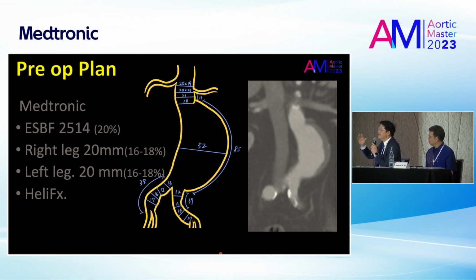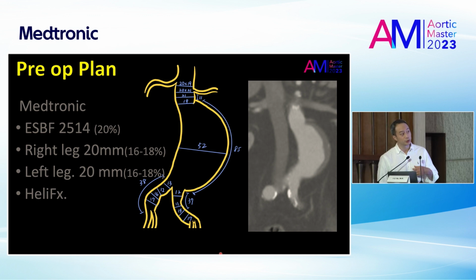No 1A endoleak? No. No immediate 1A endoleak. What is the reason? That's because this one is along with the instructions for use of the Endurant stent graft. You mean why we chose to use Endurant? Yes. Why did you choose the endo anchor for primary treatment in this case? In this case, I think both Gore or Medtronic products would go along with this case, but we kind of choose each one for each case if it applies to both cases. So we will take turns.